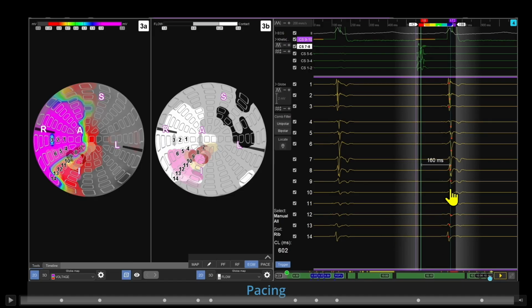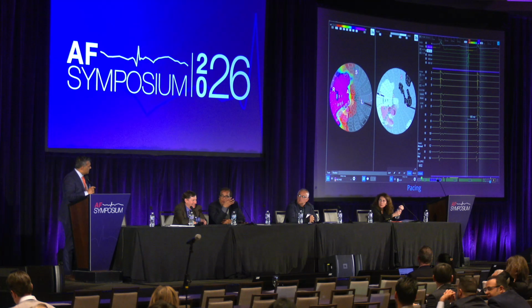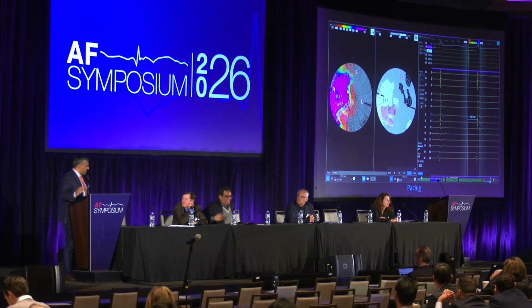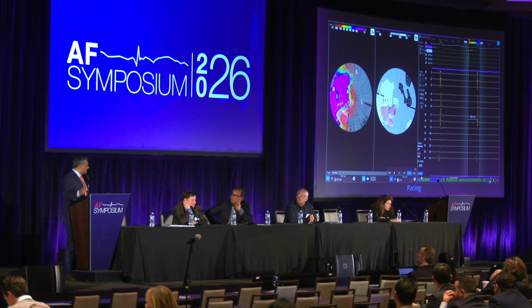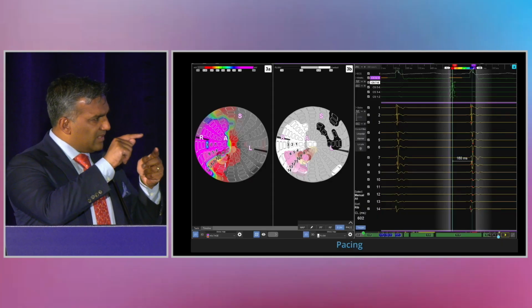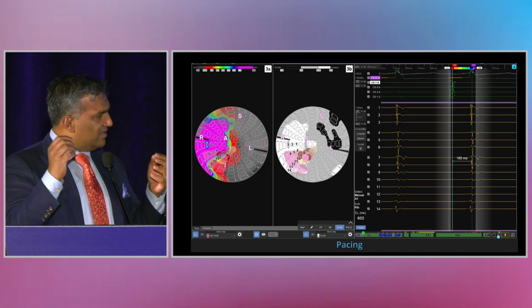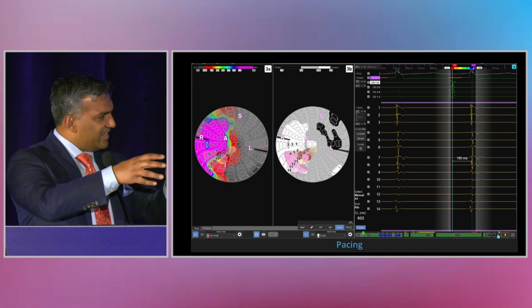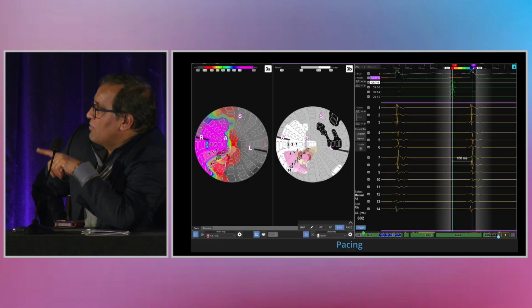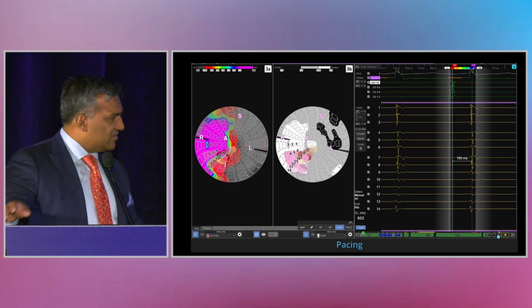Well, Vivek, you made it look like it's very easy to do. It is. Like in most things, you have to learn how to manipulate it. It is big, but once you learn that, it's actually not that difficult. The difficulty of catheter stability and electrode contact is all gone. The complexity is in the catheter, but they took care of that for you. It's choosing the electrodes of contact. That's obviously straightforward.